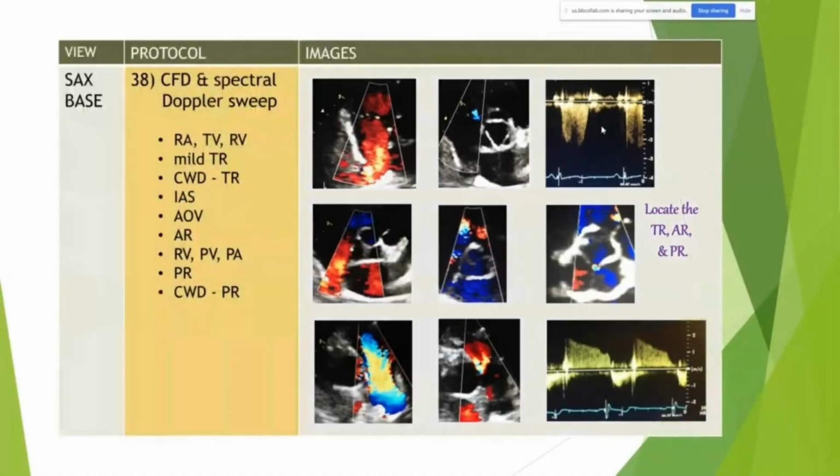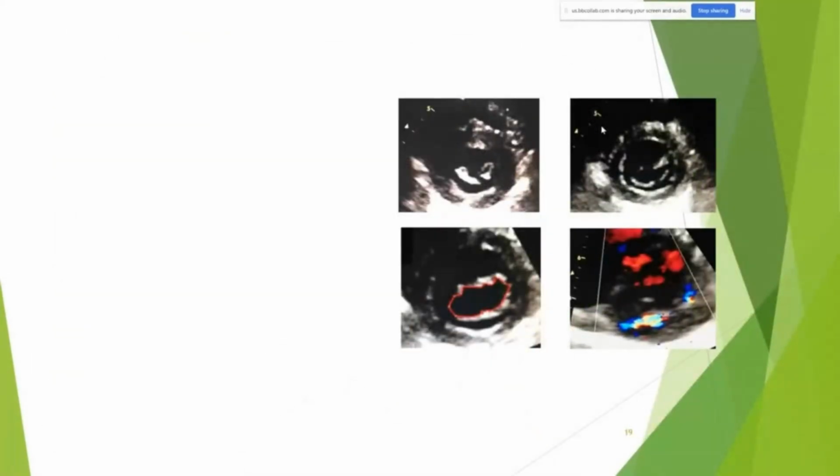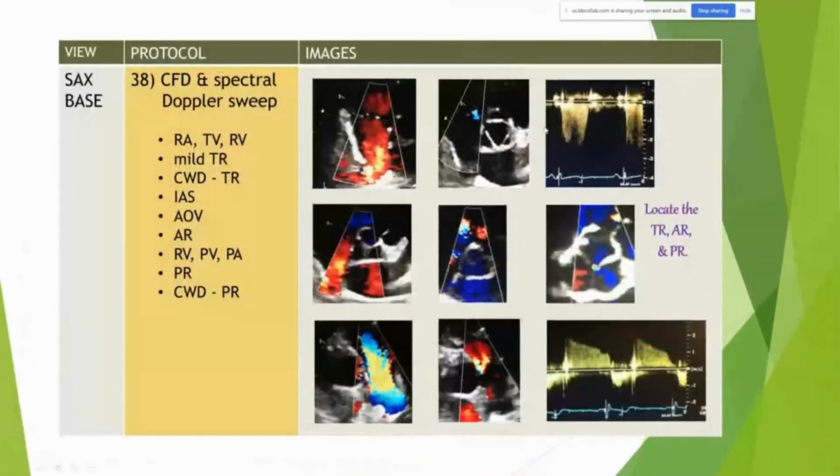Now, let's move along. Mr. May, yes. Why is it tricuspid valve again? Below the baseline is tricuspid or aortic, but if it was aortic, the flow up here would be higher because it's a high pressure thing. So this is tricuspid, this is pulmonic.